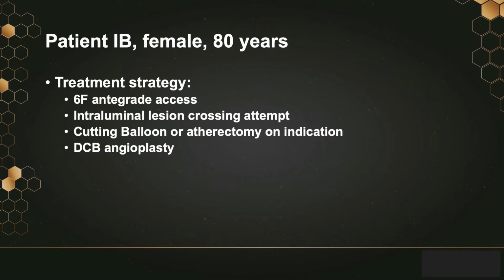A reason for a focal force balloon was basically that in 2016 there was a patchplasty done in the popliteal segment, so I assume or I expect to find some scar tissue which may be rigid against simple balloon angioplasty, and then further on I will perform a drug-coated balloon angioplasty of the popliteal artery, despite the recent talk you have heard about the Katsanos meta-analysis. In addition, I will definitely improve the outflow in some way. So next.